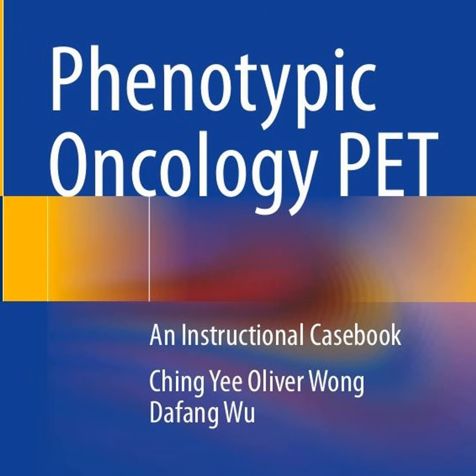It absolutely can. In case 78, they explore primary CNS lymphoma. Right, the brain scan. Yes. You look at an FDG PET scan of the brain, and there is this pronounced area of hypometabolism, a completely dark region where the brain tissue just isn't consuming any energy. And a junior clinician might look at that void and just assume the tumor has necrotized or killed off that entire section of the brain.